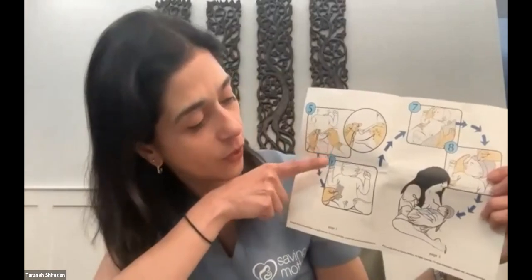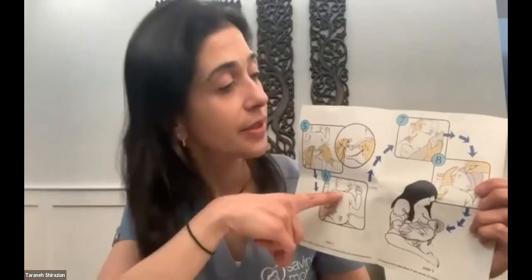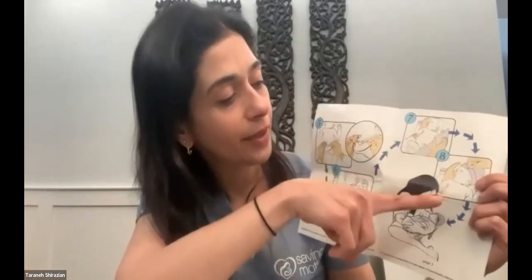Then you tie the cord, you clamp the cord, and you cut it with a razor blade because it's a non-reusable item that then won't go on and be used for a number of household chores. And then you clean the baby, hat, blanket, very simple things.